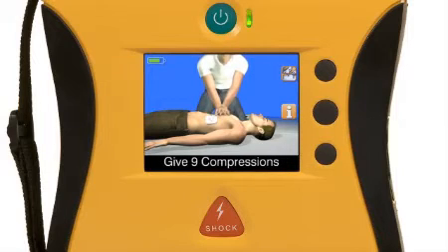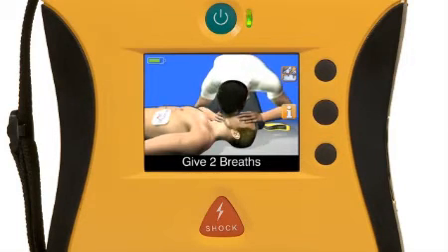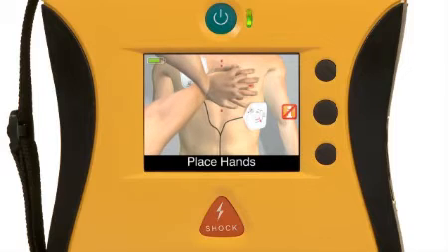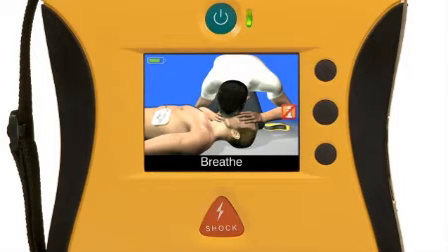As a coach, the video will show you when and how many compressions to perform, counting out compressions like a metronome. It will also show you when to give rescue breaths and when to pause for a shock if necessary. As a trainer, the video illustrates how to place your hands and how to perform compressions and rescue breathing.